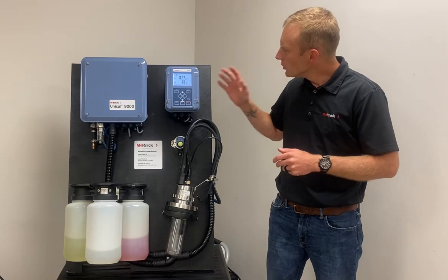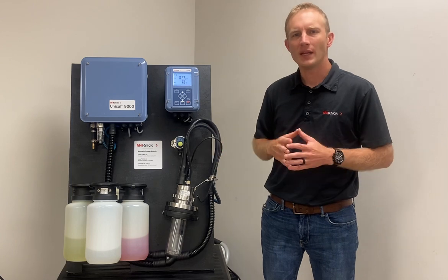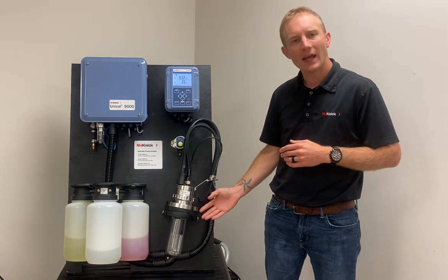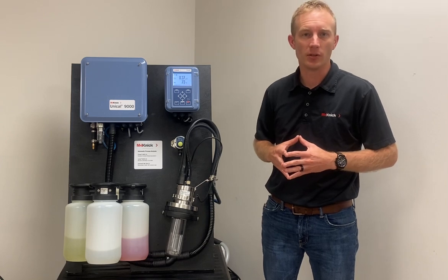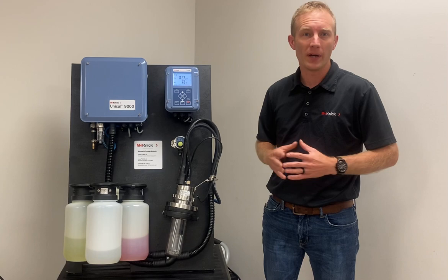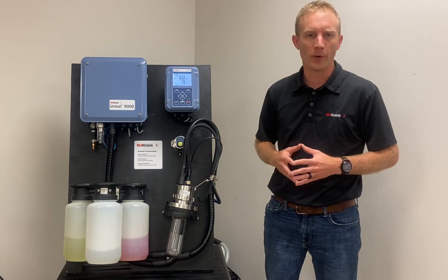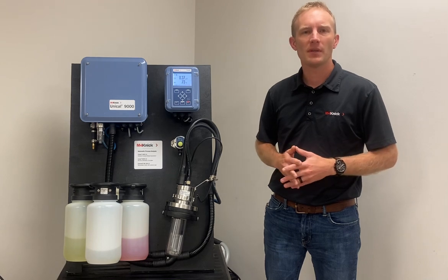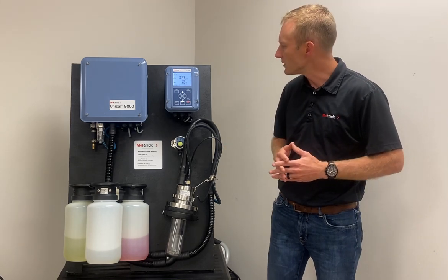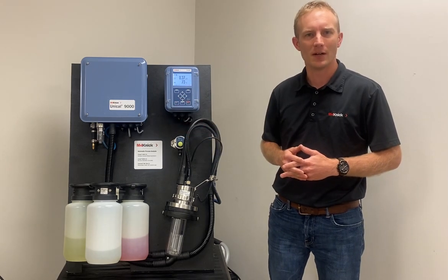Hello everyone. The Uniqal 9000 system from Kinnick is a fully automated system designed to pneumatically insert and retract a pH sensor, along with thoroughly cleaning and calibrating that sensor without removal from the retractable holder. We're going to take a little bit of time in this video to talk about the features and benefits of this system as well as go over the components that you see here in front of you.